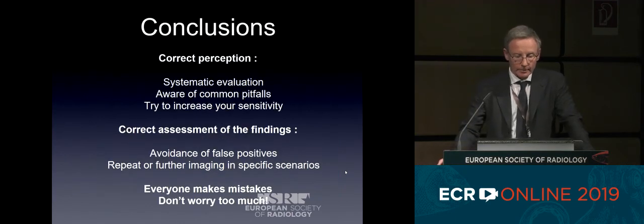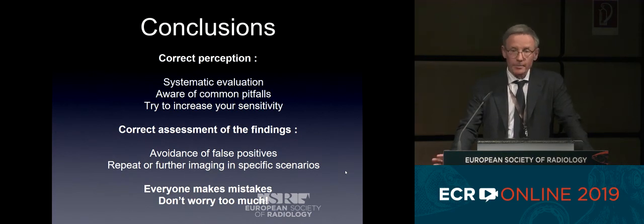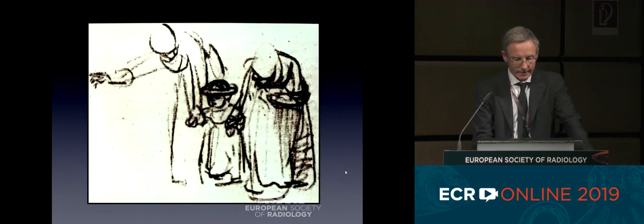So, in conclusion, correct perception depends on a systematic evaluation of the X-ray. Please be aware of common pitfalls in these difficult areas. Try to increase your sensitivity, but avoid false positives. And of course, you can always repeat imaging if you have any doubt, or request further imaging in specific scenarios. So please don't worry. Everyone makes mistakes.